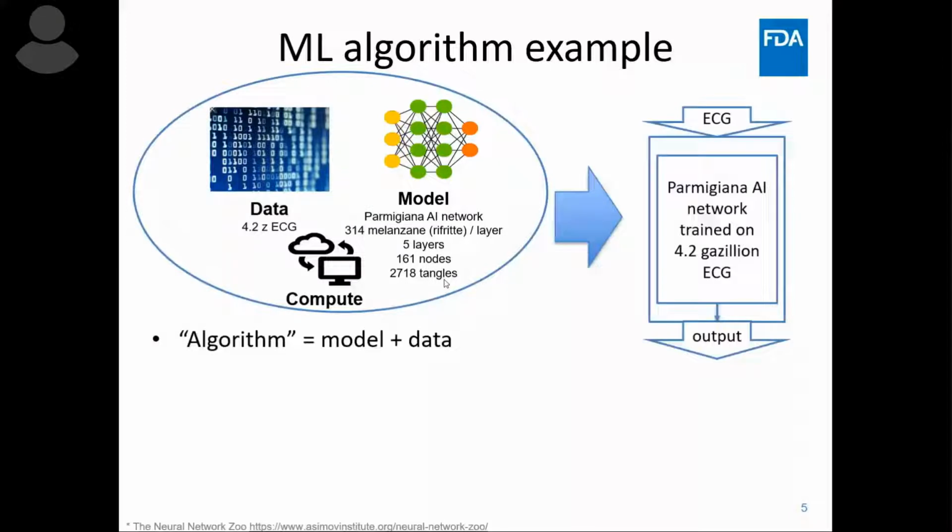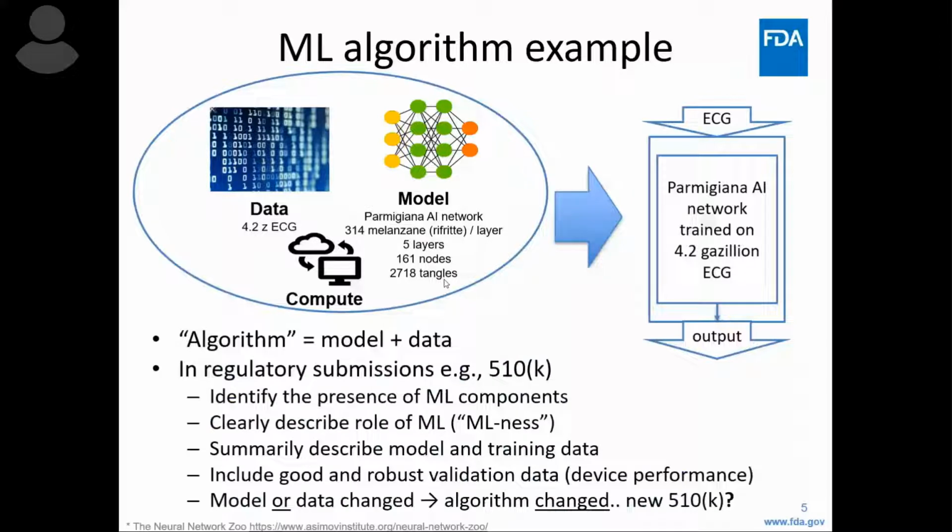In a regulatory submission, you may really want to clarify that you are using machine learning. You want to describe what this model is that you use, the data that you use, and describe the role of machine learning within your complete device. And you really must include validation data to demonstrate device performance, safety and effectiveness.